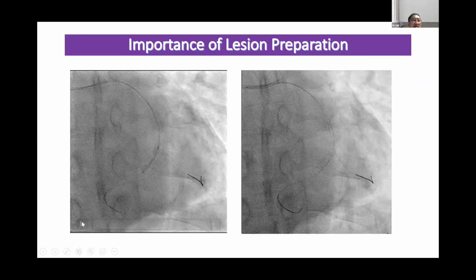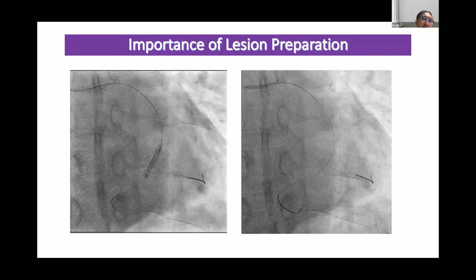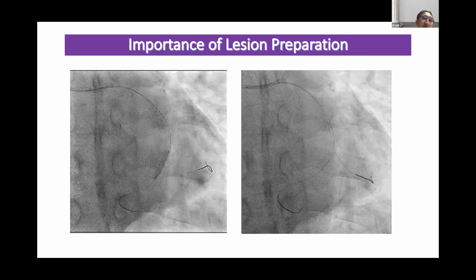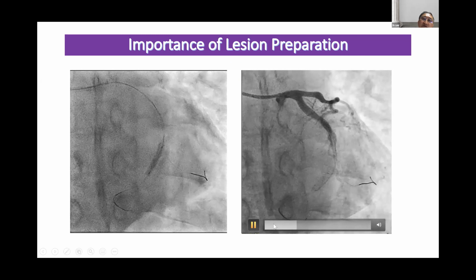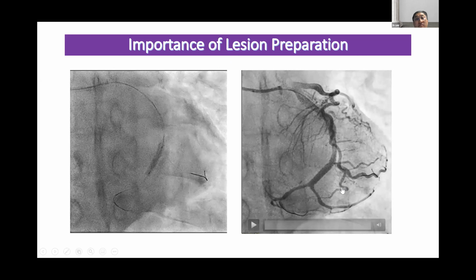And take a look at this sequence when the stent is deployed. Here the balloon went up slowly. And just towards the end, before it fully engaged, there is a proximal migration of the stent. The subsequent angio shows that it actually crossed through the ostium of that big OM branch.